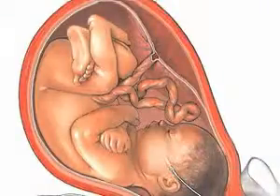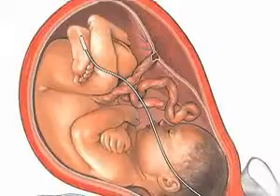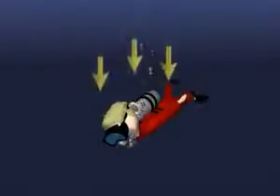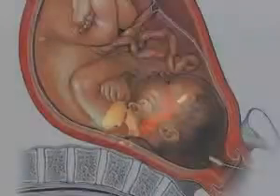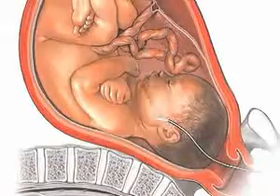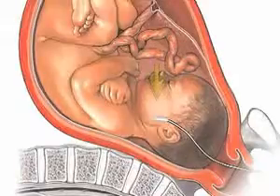The location of sensor and transducer-tipped IUPCs in the amniotic space determines to what extent the hydrostatic pressure element influences intrauterine pressure readings. For example, the deeper a swimmer swims underneath the water's surface, the stronger the pressure felt on the swimmer's ears. The same is true with the placement of sensor and transducer-tipped IUPCs. The lower the location of the catheter tip in the amniotic space, the heavier the weight of the amniotic fluid and the higher the hydrostatic pressure exerted by the fluid.